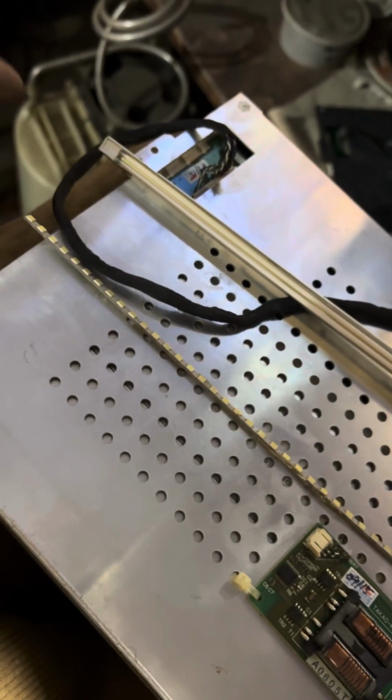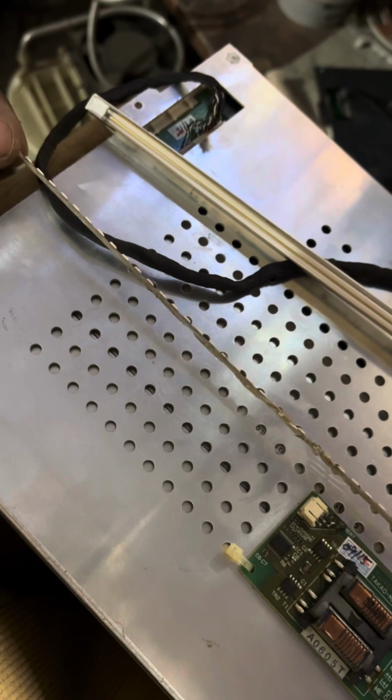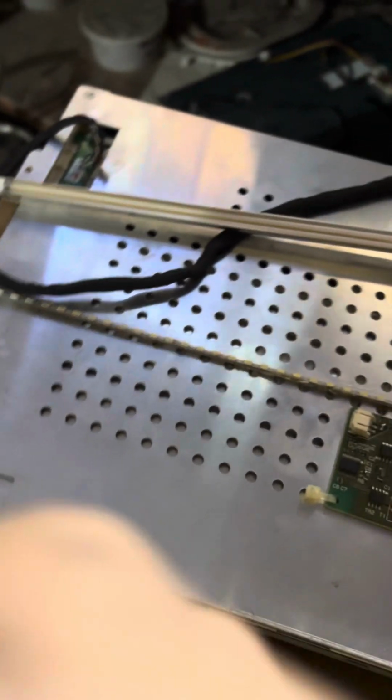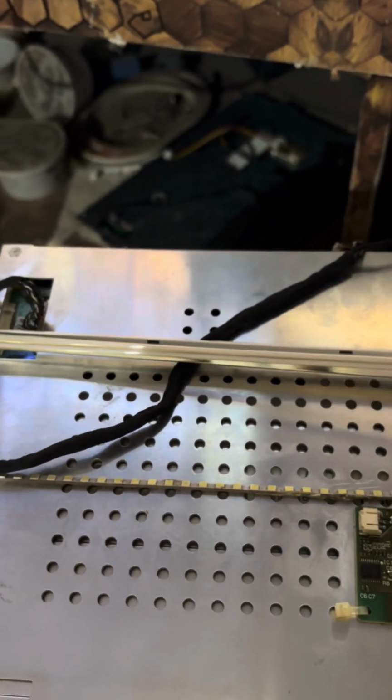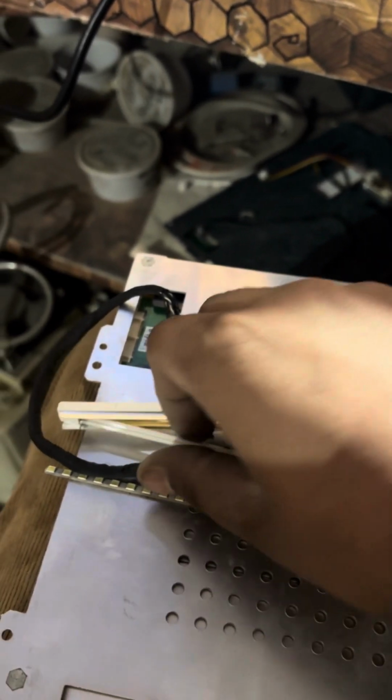You can search on the internet with the help of micro LED strip, backlight strip. So here we are replacing this lamp, as you can see here.